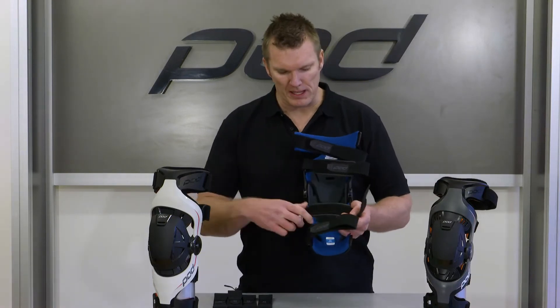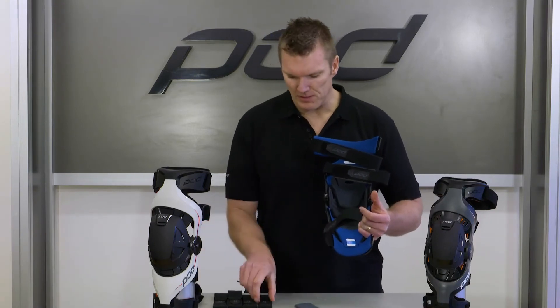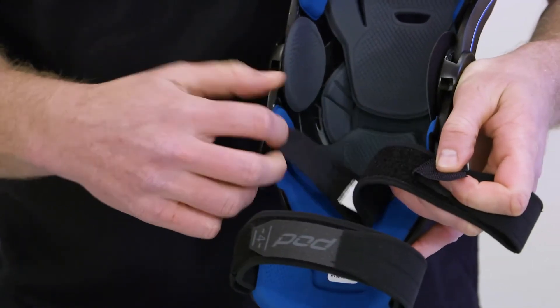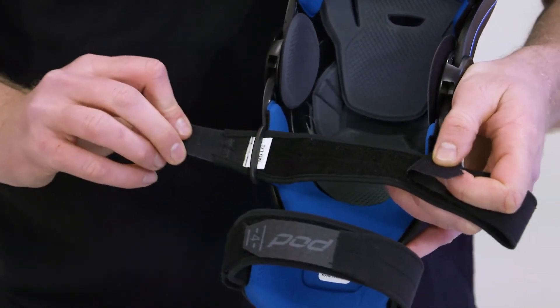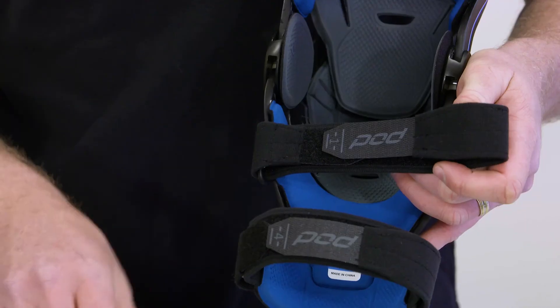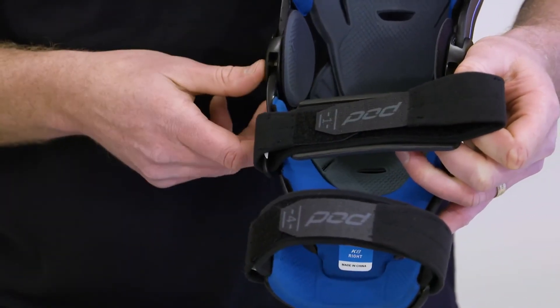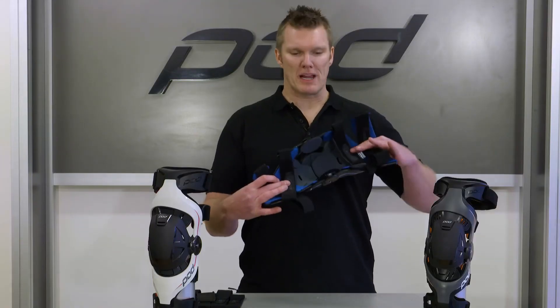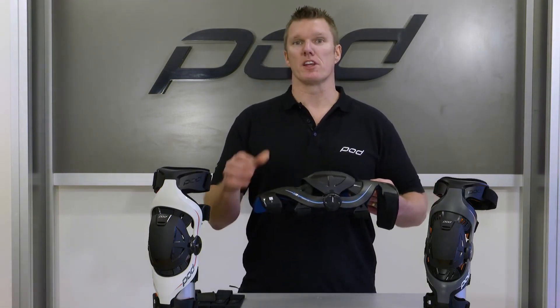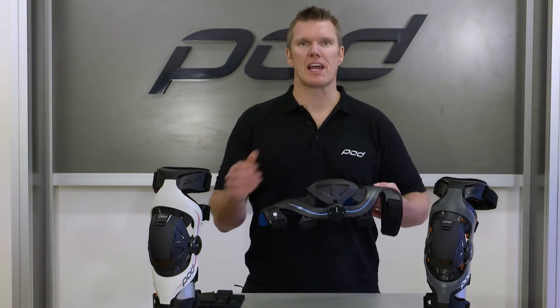Quite simply, undo the strap. From straps one and two, you can take off the strap pad and then pull out the new strap — you've got four new straps in your packet. In the exact same manner, just slip that on, try to mirror the length you had prior, put that strap pad in place and you're ready to go. That's how simple it is to replace the straps on your K-Series brace. Log on to podactive.com to look at any other videos for replacing components from your K-Series brace.